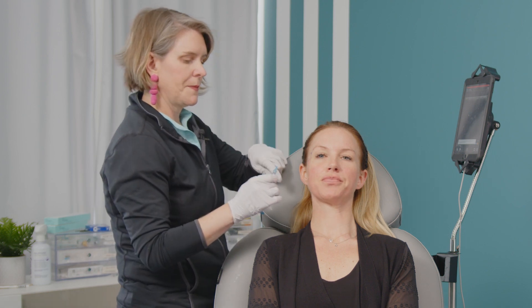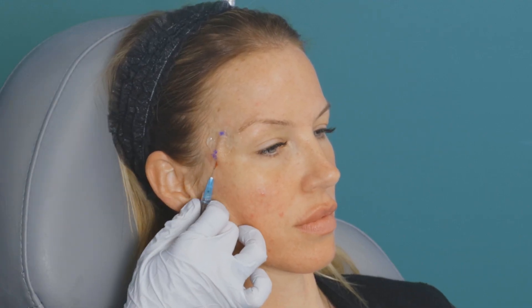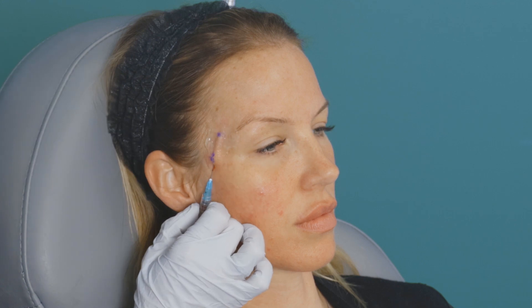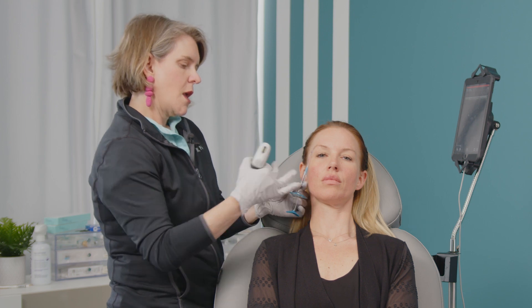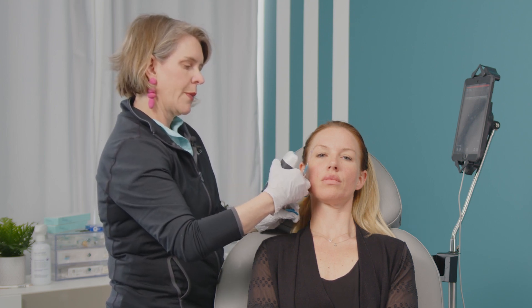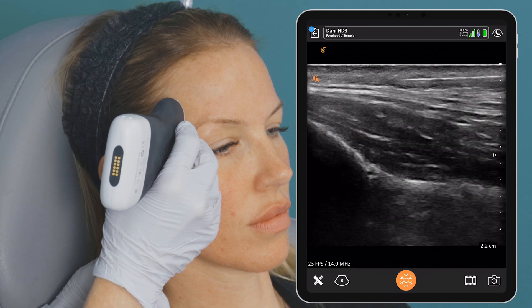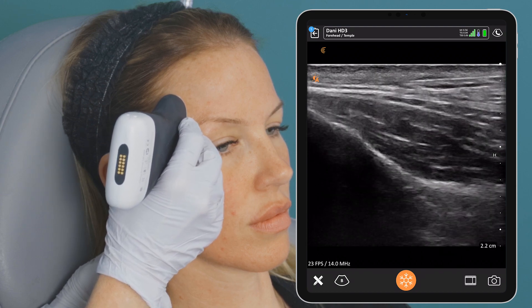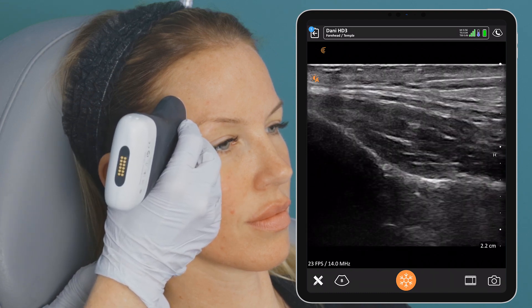I've got my very low G prime product because I'm going to go superficially. To make sure I'm sub-Q, I'm just tacking the skin down and sliding up — it should be a very easy glide plane, very easy, usually doesn't hurt. Now you can see my point A to point B — there's my point B, that's the depth of my pool. I'm going to go back with my ultrasound and make sure I'm in layer two where I envisioned. And I'm exactly in layer two where I want to be — you can see that's all sub-Q tissue, and my cannula is right there at the top.